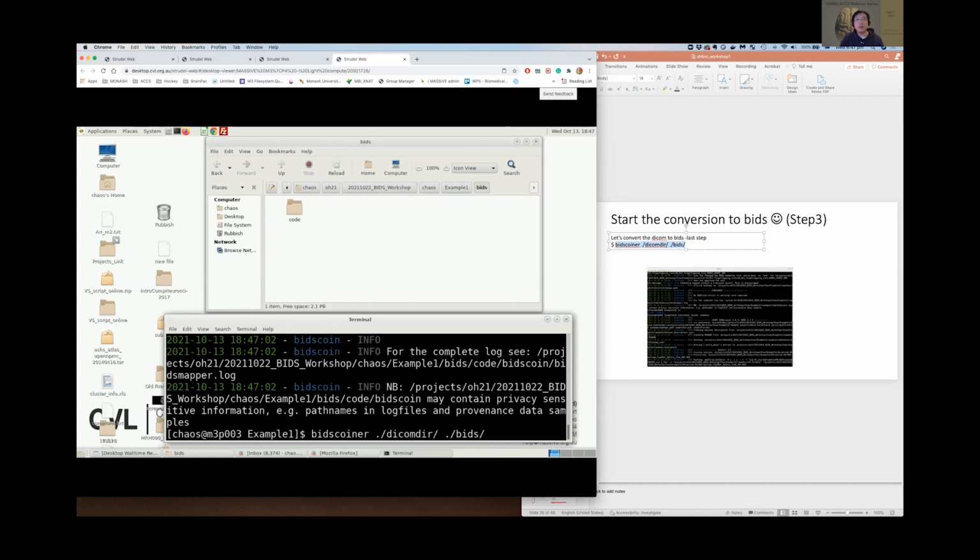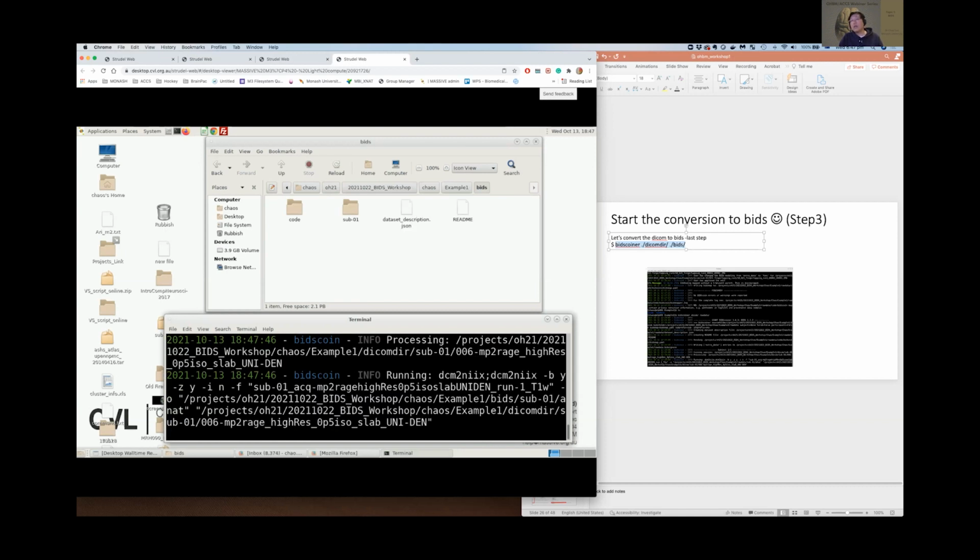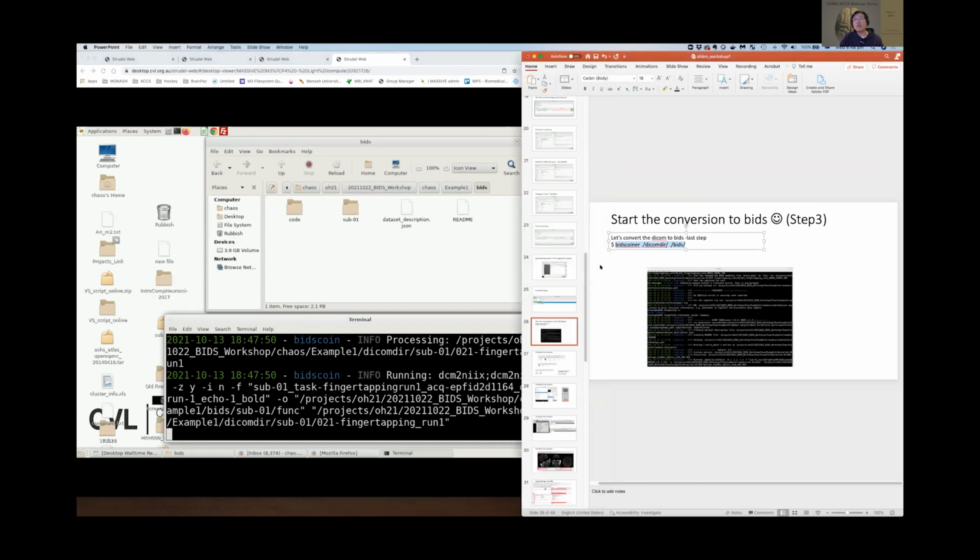Oh, it is working. It's simply the BIDS coiner command, with the input DICOM directory and the output being the BIDS folder. You can see it start to generate something. It is working. I've got my README, my dataset_description.json, and all of the other files that we stacked, and during the BIDS validation the warning should pop up.